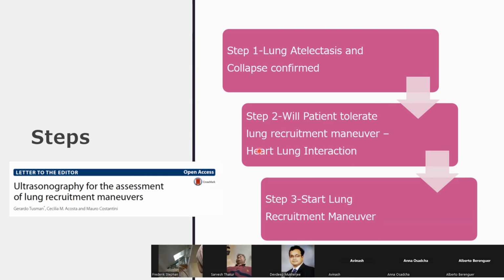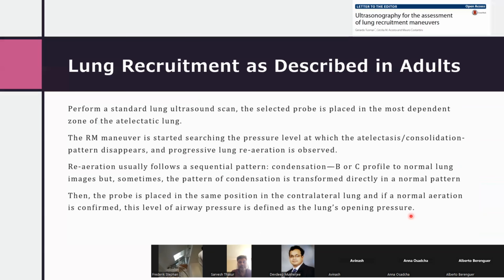I've done an echo. The treatment there is not lung recruitment. This baby is on 5 mils per kilo. I've got good CO2 clearance. Actually, the risk is if I increase and try to recruit lung, I'll cause air trapping because this baby is already 9 posterior ribs on a chest x-ray. This problem is basically pulmonary hypertension. That baby needed nitric and showed a good response to it. So actually, that's a situation where doing a recruitment maneuver would have made my baby more unstable. So I've used heart-lung interaction to make my assessment, and actually that was against using a recruitment maneuver.